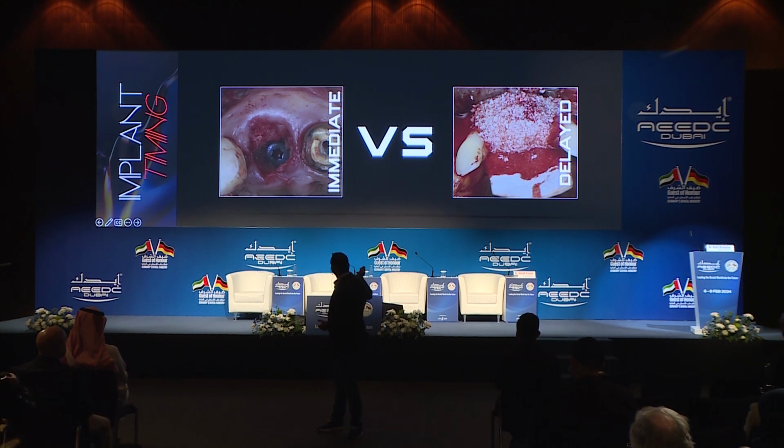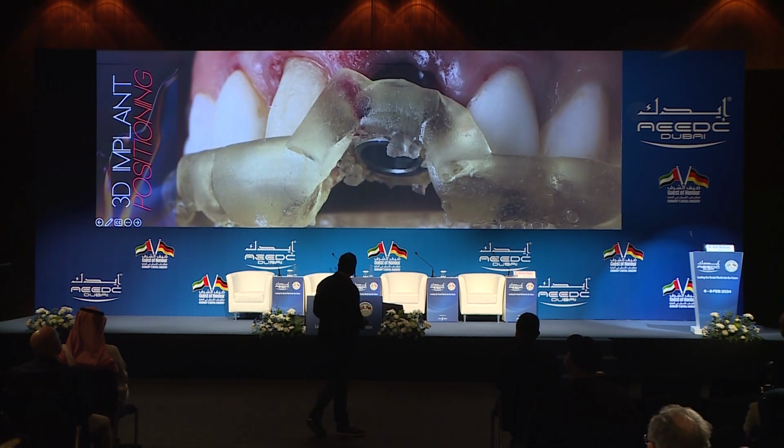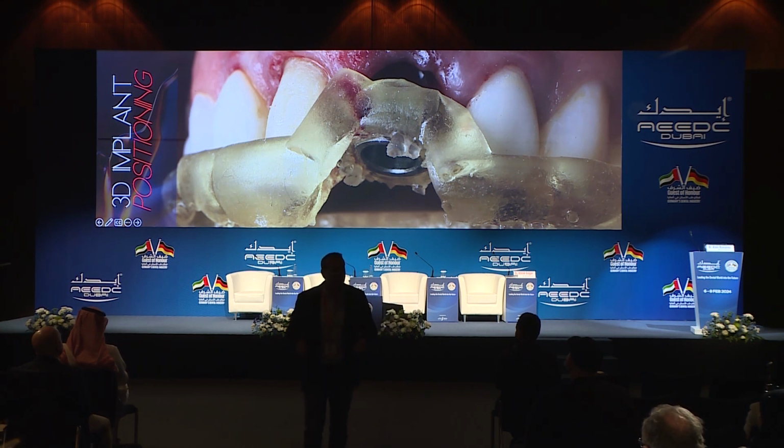There are some cases where we like to do immediate; of course, this is our primary goal. But in some cases, too many miracles at the same time is not very recommended. So we just stage it. In other cases, well, today we have an in-house lab and a printer. Today with the printer, this guide doesn't cost us much, $3. That's it. And it saves you so much time and stress.